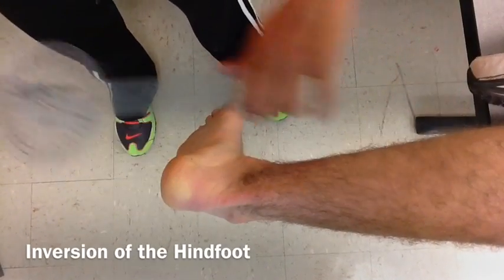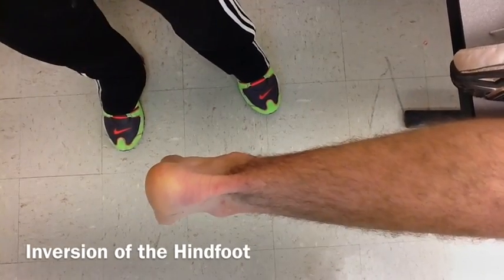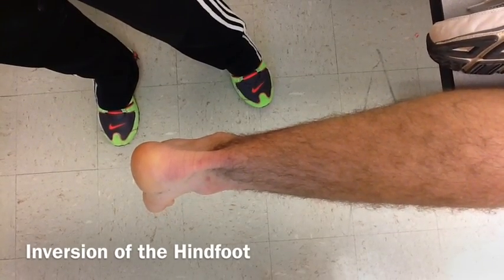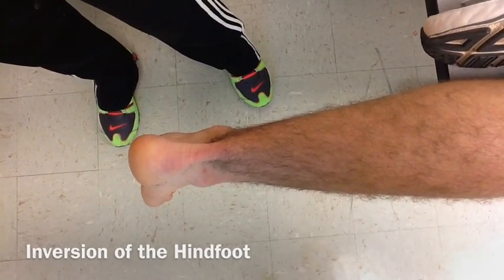The result is 20 degrees range of motion. This is normal because the normal range of motion for inversion of the hind foot is 5 to 25 degrees.